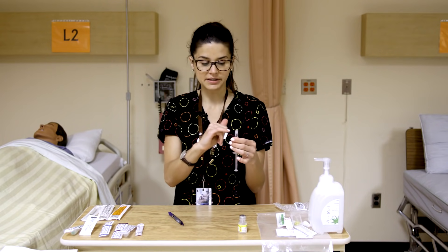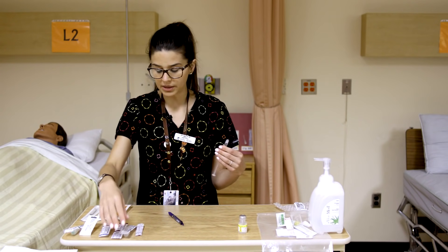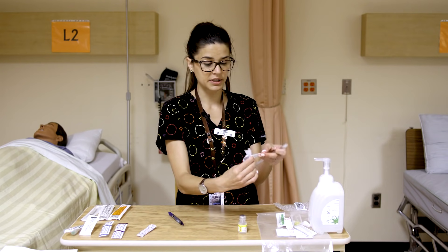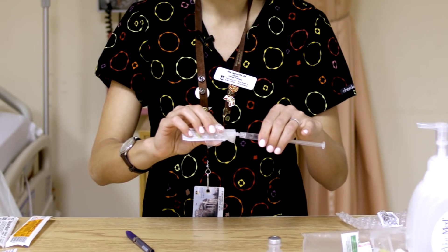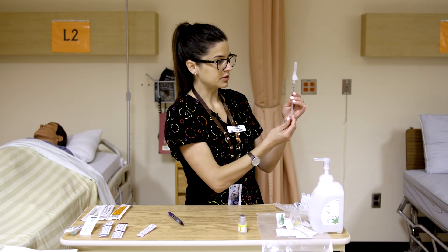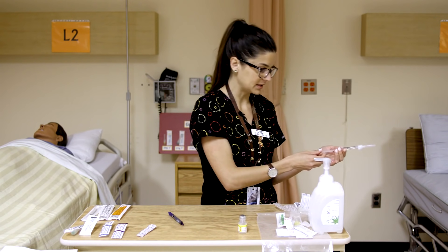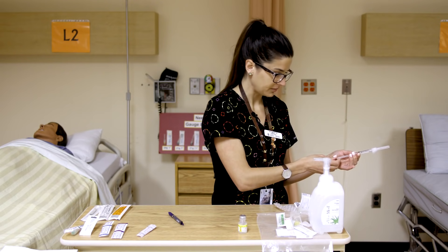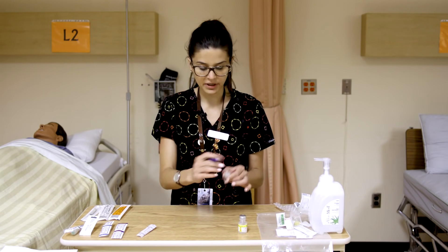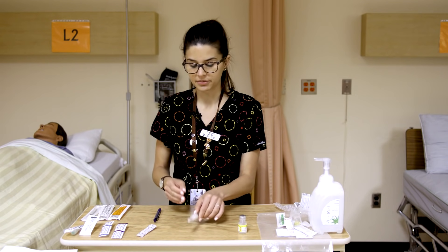We want to maintain sterility of the syringe tip, so we're not going to touch it or put the syringe down on the table. Attach an injection needle now to keep it a closed, sterile system. When opening the needle, hang on to the bottom part, don't touch the hub, keep it capped, and do the twist lure lock motion. Then push the plunger all the way up over the medication waste container to expel to the desired 2ml amount.